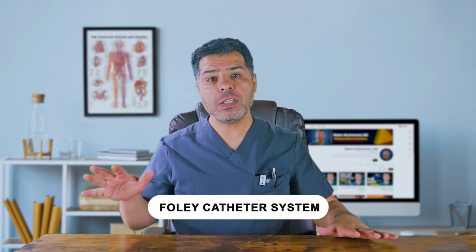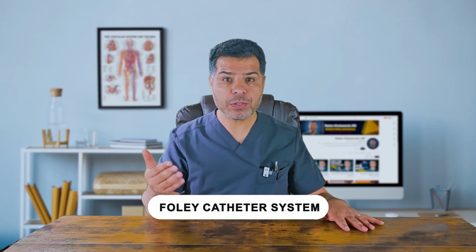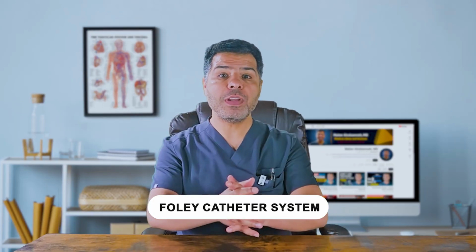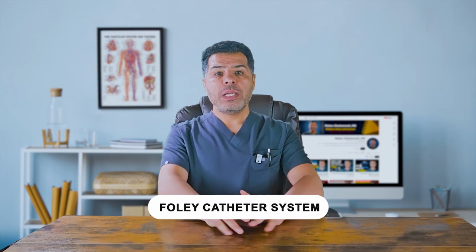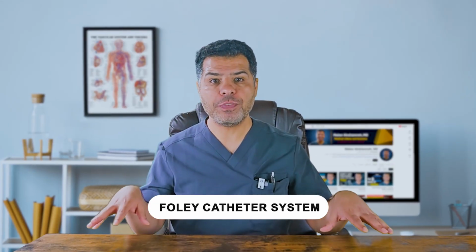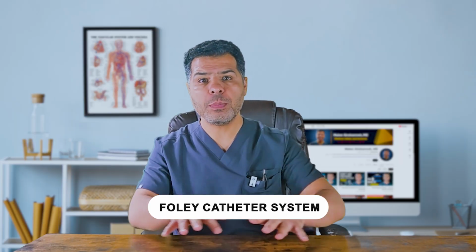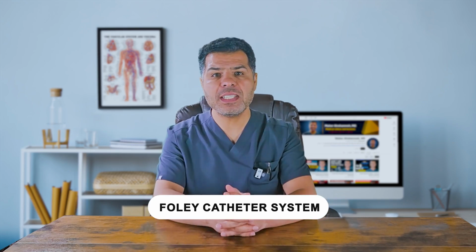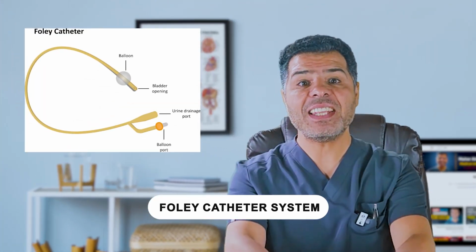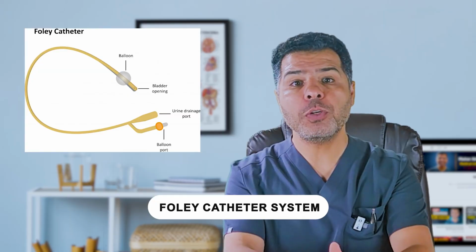Let's talk about the Foley catheter system itself. A properly functioning urinary drainage system should continuously drain urine from the bladder, maintain a closed sterile system to prevent infections, and prevent backflow of urine into the bladder. Let's break down the components here. The catheter itself comes in different sizes measured in French. Large sizes like 18 to 20 French are used in patients with hematuria or clots, while smaller sizes like 14 to 16 French are standard for routine use. The catheter has a drainage lumen, an inflation lumen for the balloon, and multiple drainage eyes at the tip.